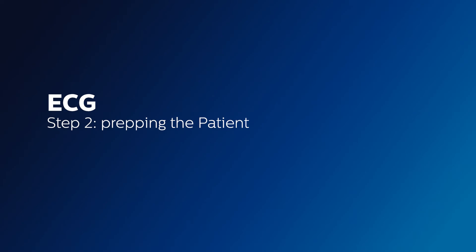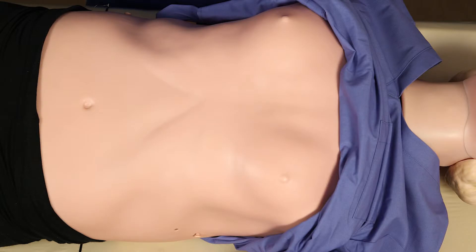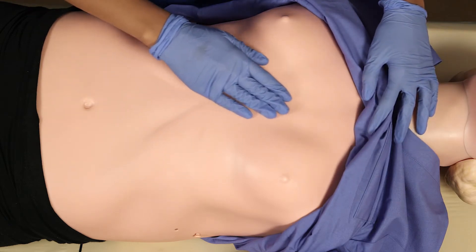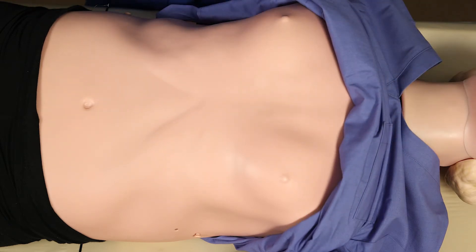After you have chosen which cable and quatrodes to use, the next step is to prep the patient. It is important to shave any patients with excessive hair. If the hair creates an arc behind the quatrodes, it can be a burn hazard.